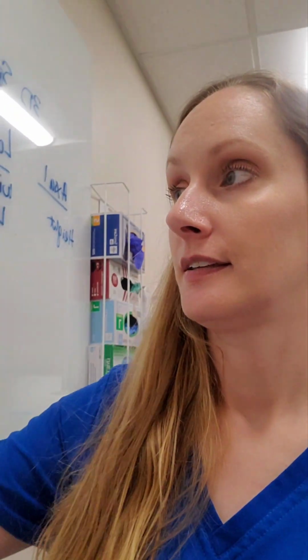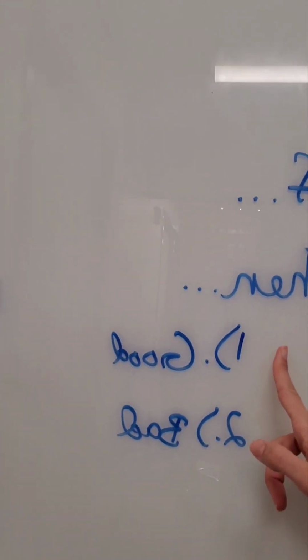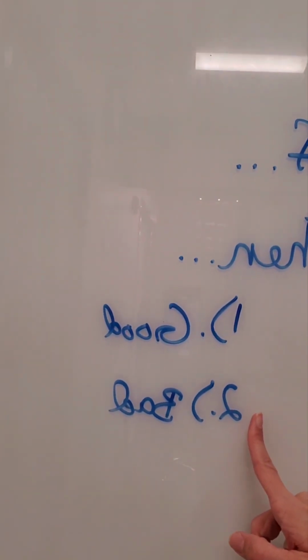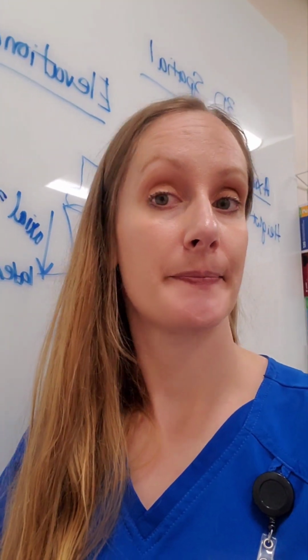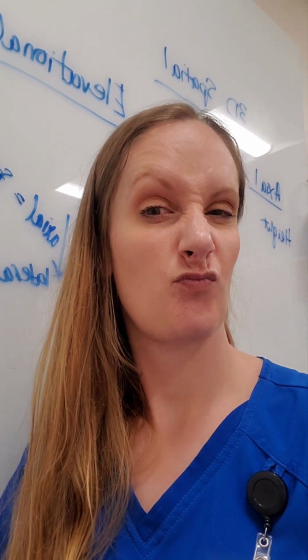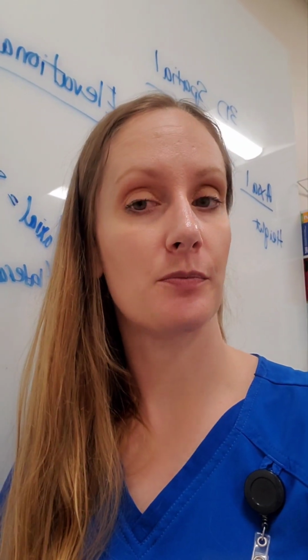If I increase the frequency, then what happens? Well, I get better resolution and poor penetration. Why? Why does resolution increase, get better, if I increase frequency? And why does penetration get worse? What happens with absorption?